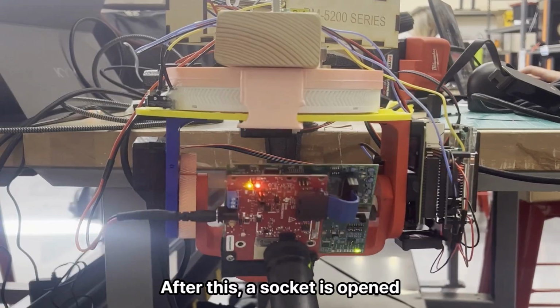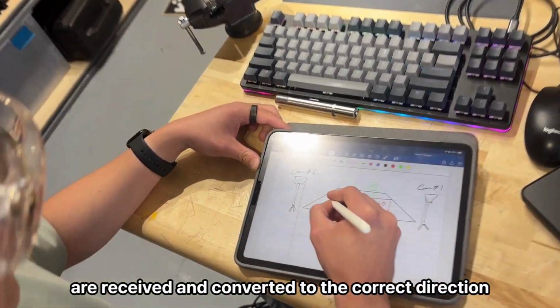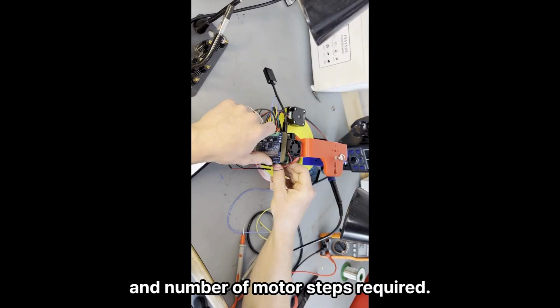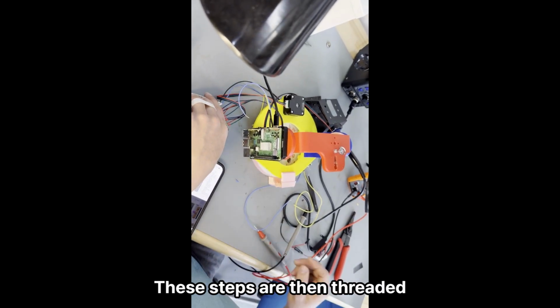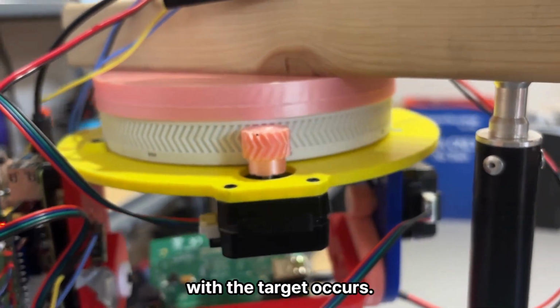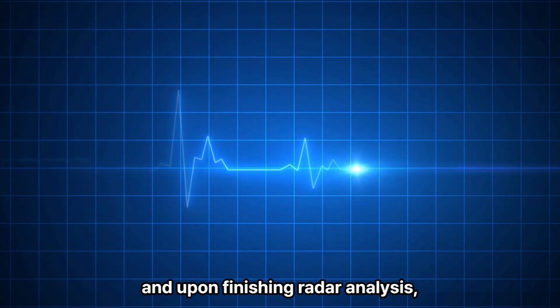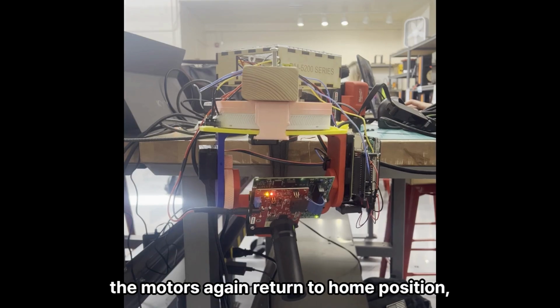After this, a socket is opened to talk to the Jetson, and the rotation angles calculated previously are received and converted to the correct direction and number of motor steps required. These steps are then threaded to the motors such that simultaneous rotation and alignment of the radar with the target occurs. The radar itself is then initialized to take measurements, and upon finishing radar analysis, the motors again return to home position, awaiting new orders.